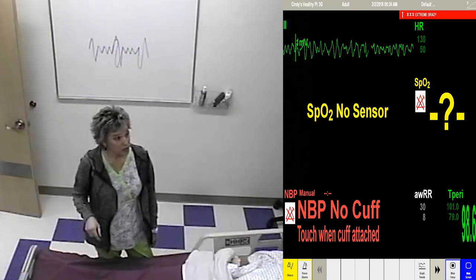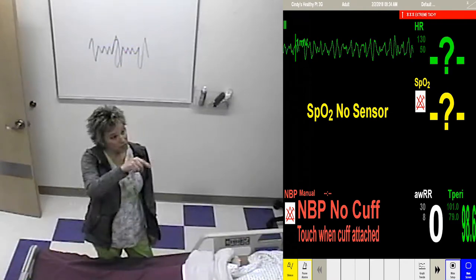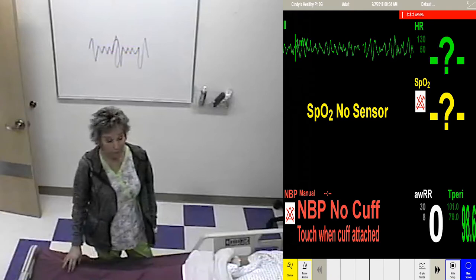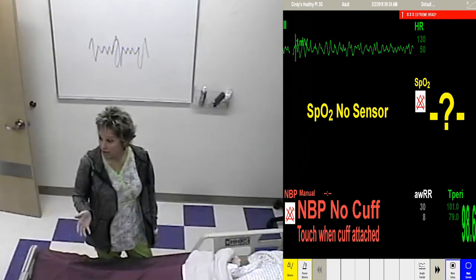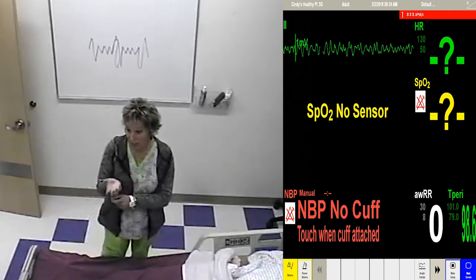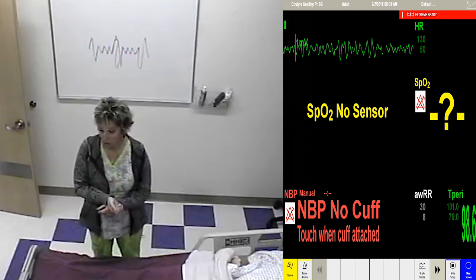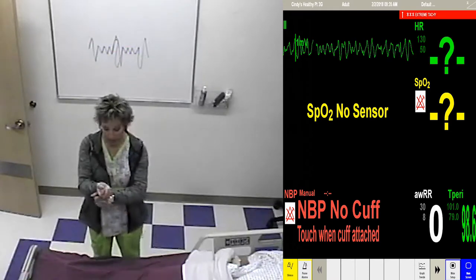Ventricular. Now, do you remember our jello from the atrial fibrillation? Does this one look kind of the same? Some gobbledygook in there? This one is ventricular fibrillation. Remember in AFib, the ventricle was working, but the atria was fibrillating. This time, they're both just fibrillating. So this is ventricular fibrillation.